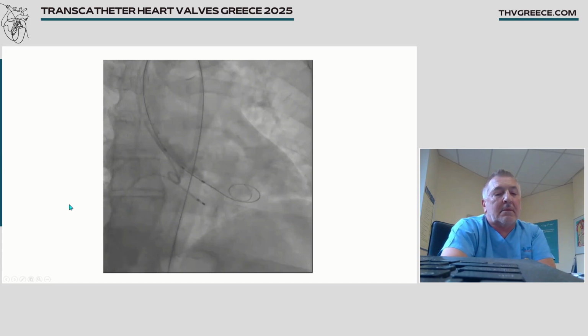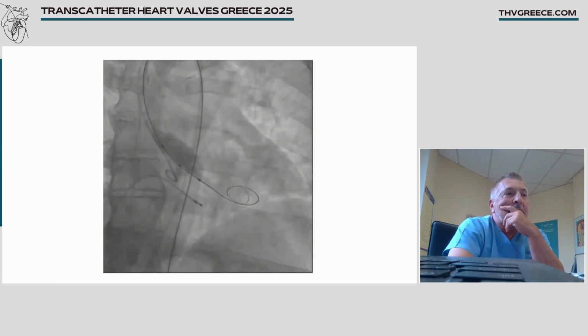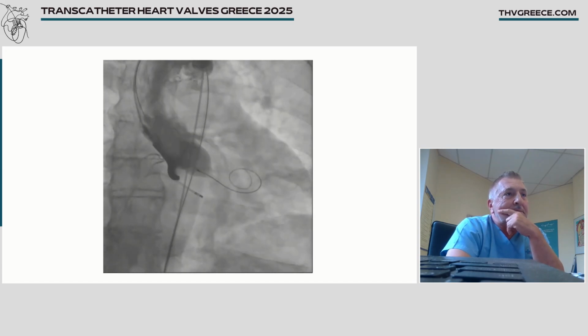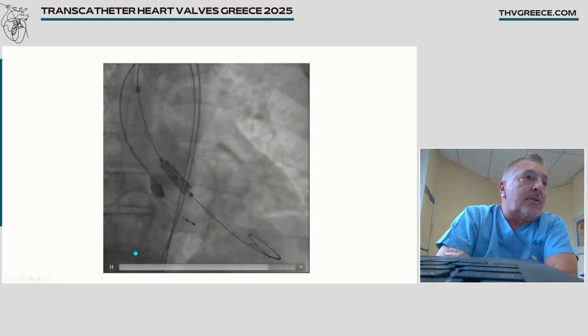It was a 25 balloon. Please speed up a little, because each one has 5 minutes. Okay. And this is the implantation of the valve.